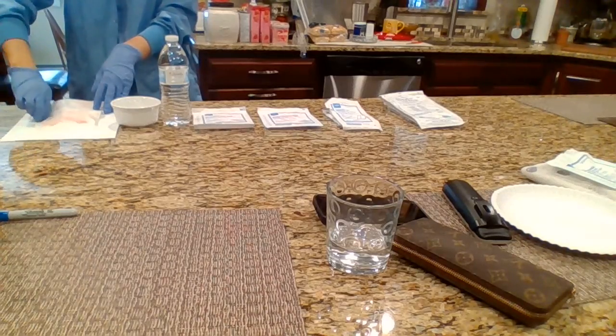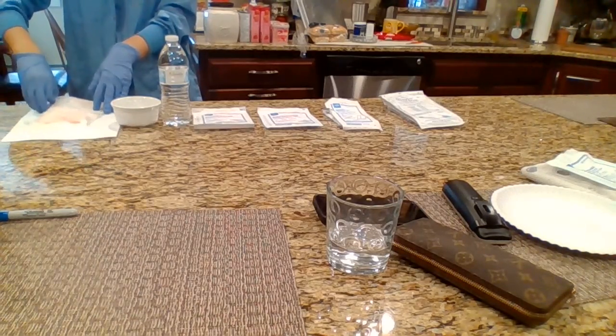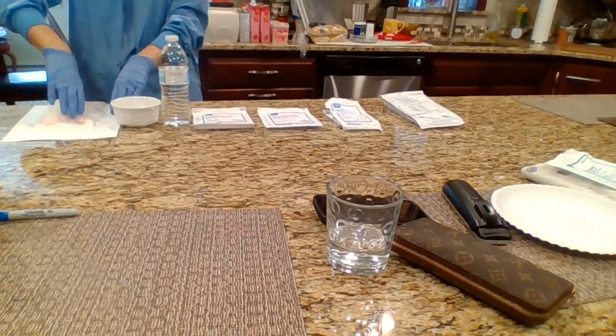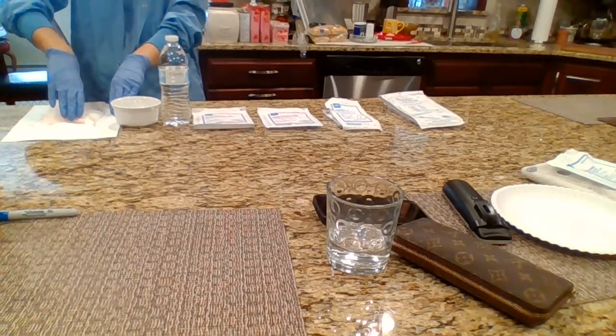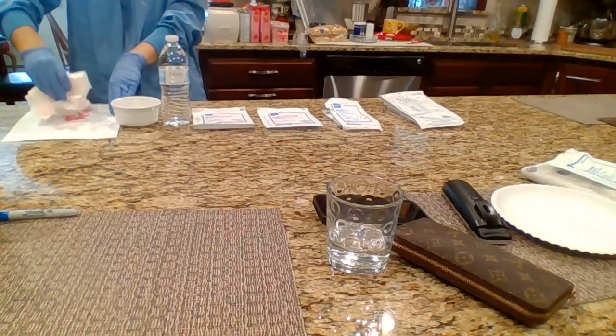Okay, and once I get it off, I want to fold in half, getting both the primary and secondary dressings at the same time. I want to fold it in half so the patient doesn't see what's on the inside of the dressings, and I want to toss it into the trash can. So it's going to look like this.